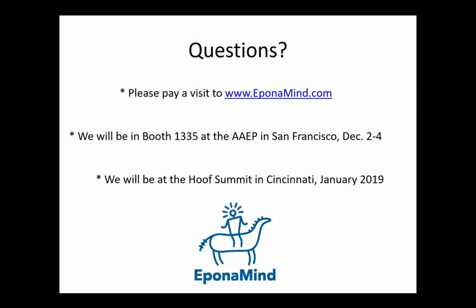If you're in a situation in which a vet doesn't have any kind of scale marker, is there something practical, such as a quarter, that can be used as a marker? Yeah, you can, if you have to, use anything of known size. The trick is you need to put it in the so-called plane of interest. With a lateral X-ray, one thing we can do is take a farrier's shoeing nail and tape it to the center line of the hoof, pointing down at the toe. That'll show up in the radiograph and be a scale marker. But you'll have to remember what size nail that was.